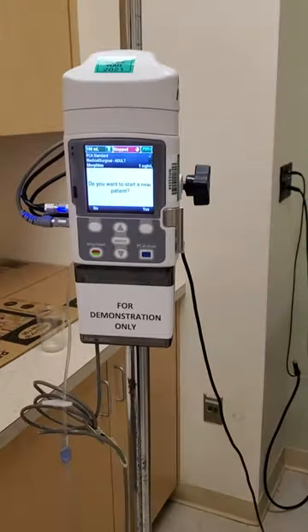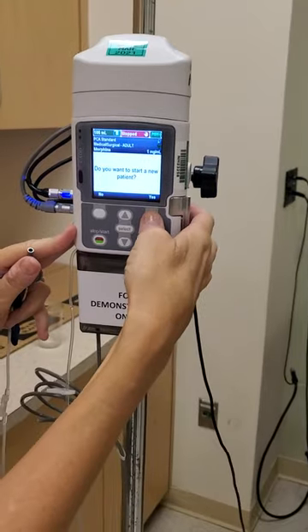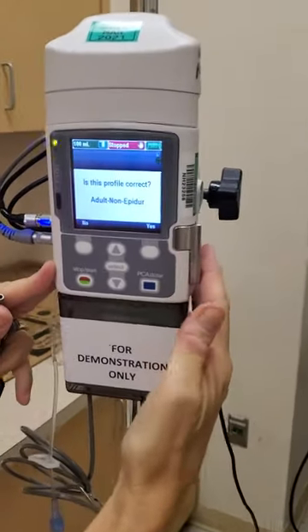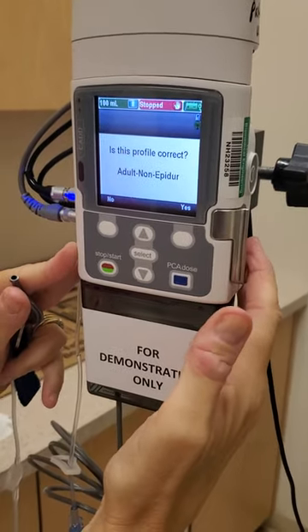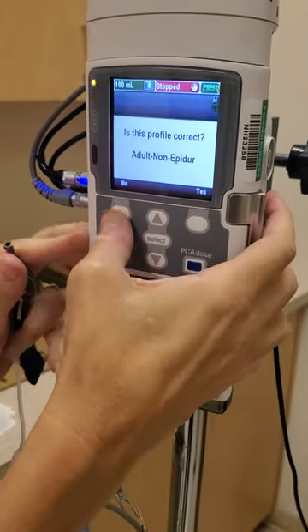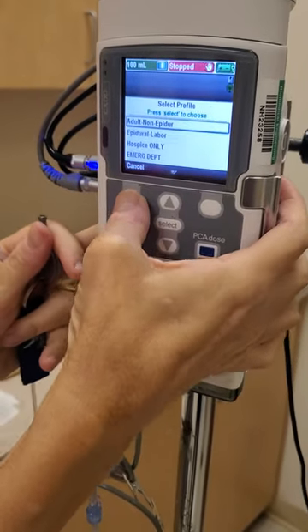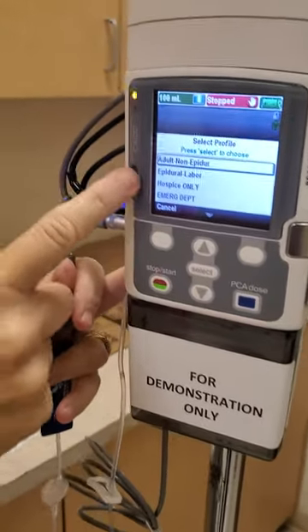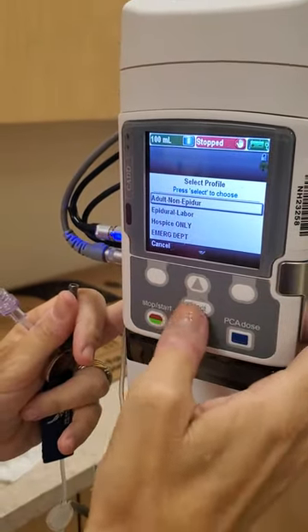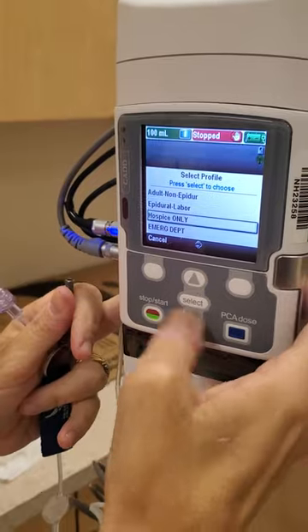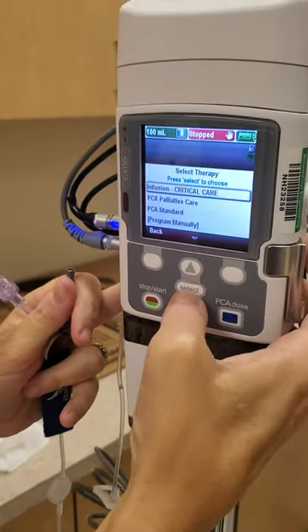It's asking me, do I want to start a new patient? For demonstration purposes, I'll say yes. Then it asks, is this profile correct — adult non-epidural? I'm going to hit no just to show you that there are other profiles you can select. I'll highlight adult non-epidural and select it.